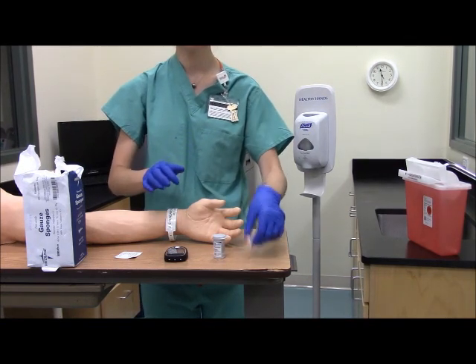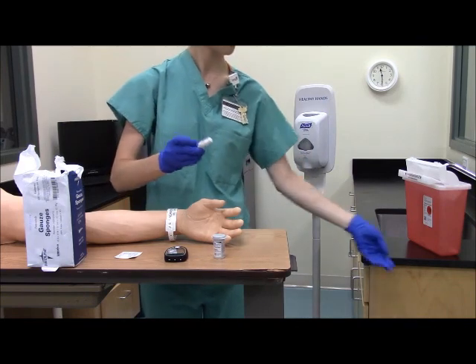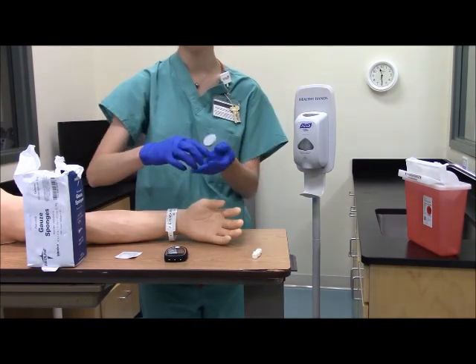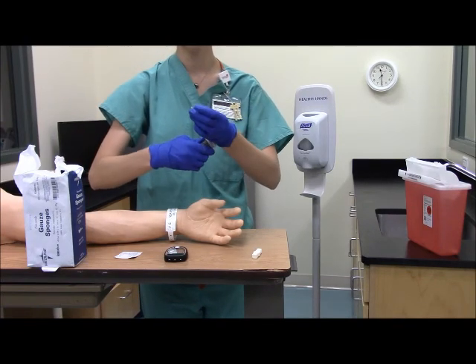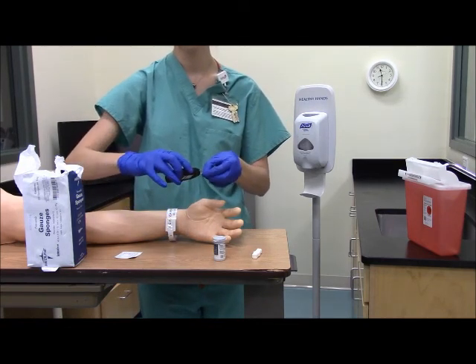Prepare the lancet using aseptic technique. Go ahead and remove the test strip from the vial and recap it immediately. Check that the code number for the strip matches the code number on the monitor screen. Insert the strip into the meter.